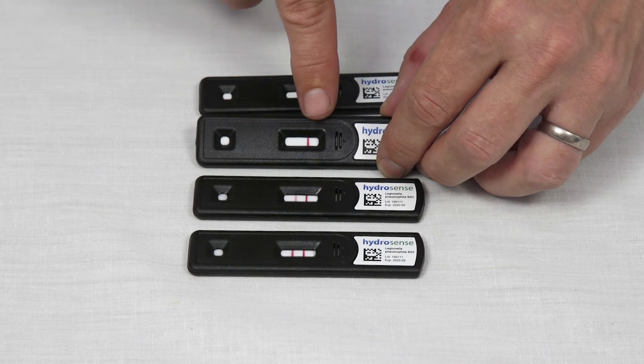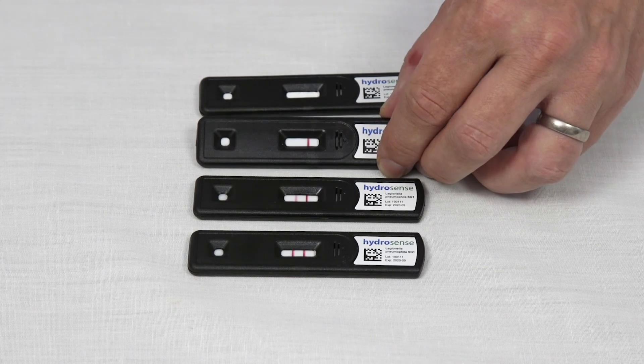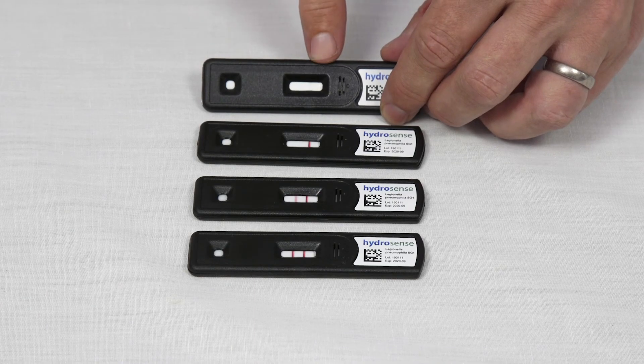If no test line is present but there is a control line, then the test is negative and Legionella pneumophila serogroup 1 has not been detected. If no control line is present, the test is invalid and should be repeated.